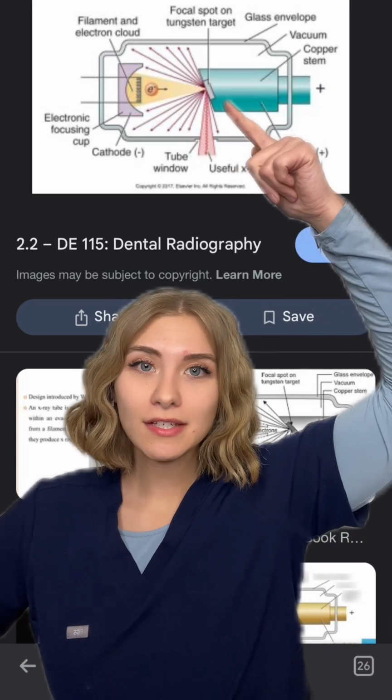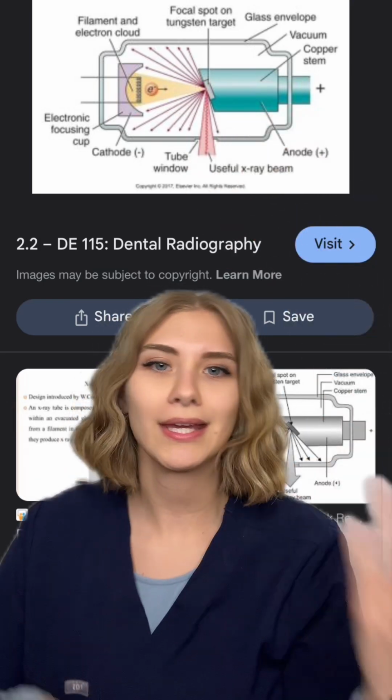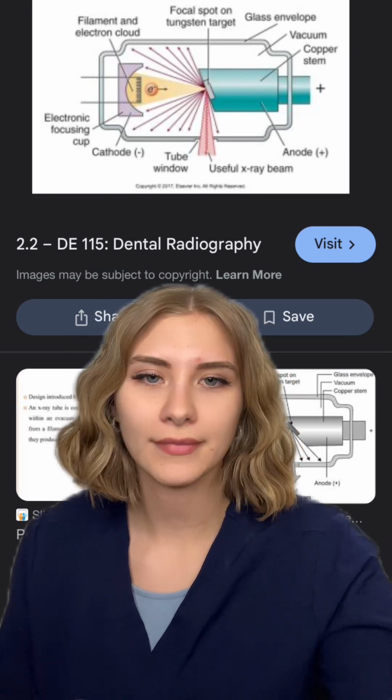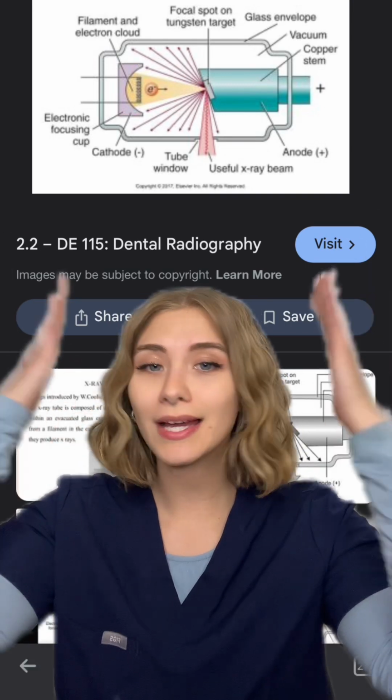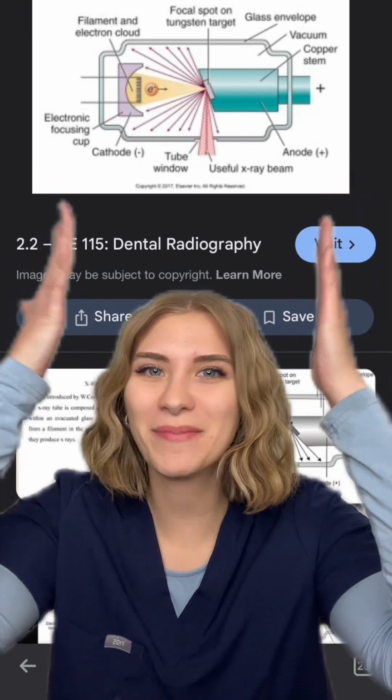Anyway, so from the tungsten target, it then goes out to this tube window, where there are these other things like lead collimators and aluminum discs. But we can talk about that in another video about the whole thing. But that's basically how radiation gets emitted from an X-ray tube.